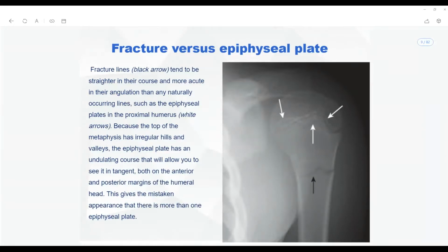When you are trying to understand these kinds and differentiating it from the shaft, epiphysis, the metaphysis and the diaphysis, there is a classification that is called the Salter-Harris classification of fractures. Okay, we will learn this one today. Salter-Harris classification of fractures.